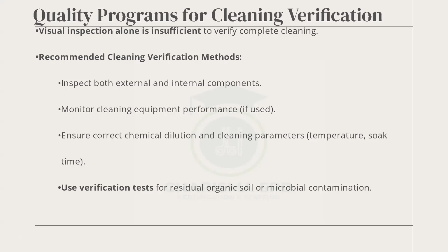Visualization, a quality program for cleaning verification. So visualization alone is insufficient. All right. Just by looking is insufficient. You can see outside, but you cannot see the debris, the whole of the debris or bioburden that is inside. So it is recommended that a cleaning verification method be done. Inspect both external and internal components. Monitor cleaning equipment performance if used. Ensure correct chemical dilution and cleaning parameters. That is, if you are using a machine that is doing the cleaning.